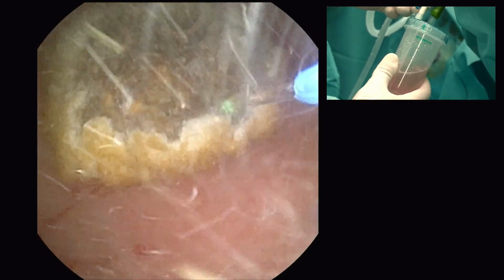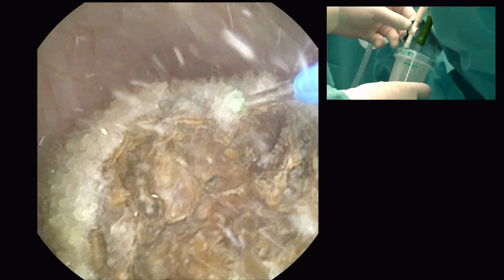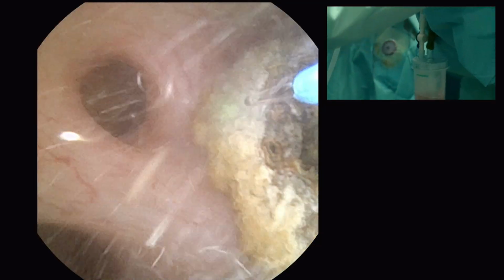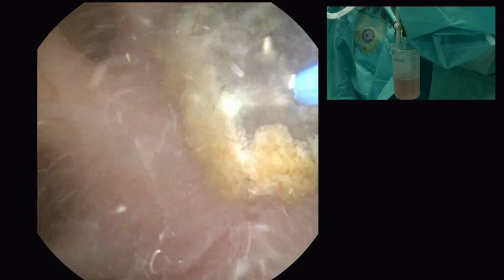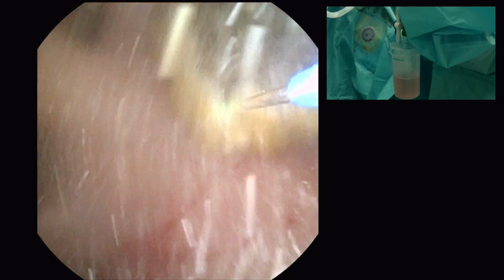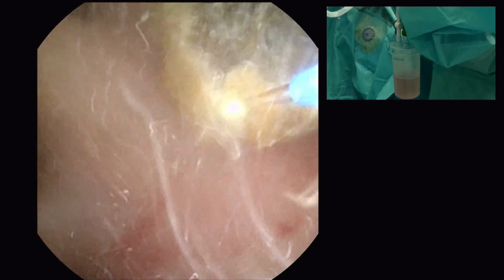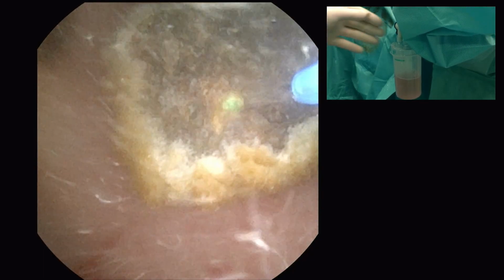So what is the source of irrigation? Is it straight from a bottle or using a pathfinder? You have to be very careful about the inspiration and expiration. You can tell the anesthetist, if you are not comfortable, to decrease the tidal volume. This is Dr. Imran here. Sir, how are you using the irrigation? Is it a pathfinder you are using, or just an irrigation pump?